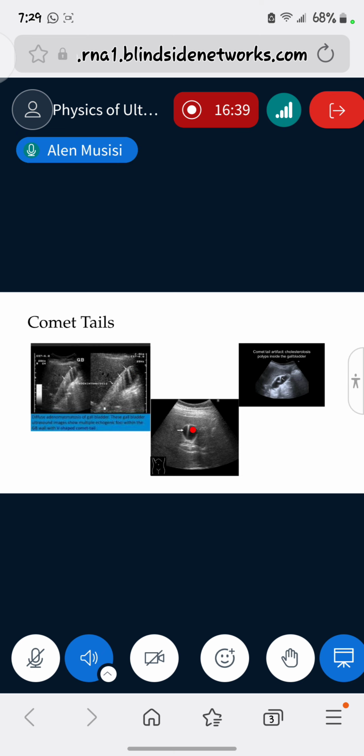You see them, like this one here. There's another one there. So you see a signal coming from a certain point and then it goes down. It also reduces in brightness. And if the system was to magnify this image thousands of times, you would see that these echoes are just repeated downwards.